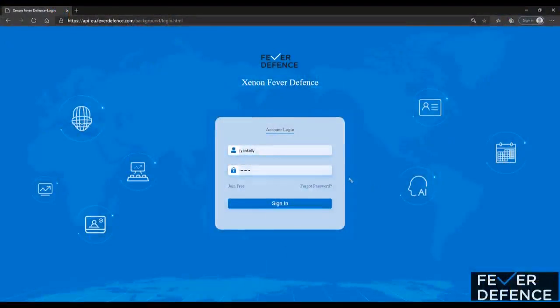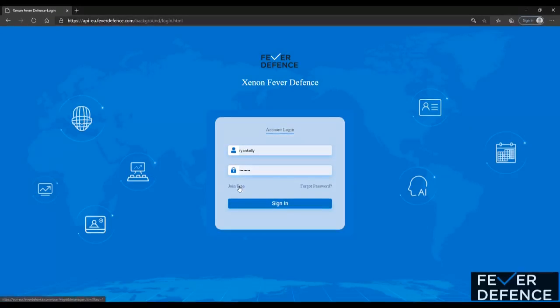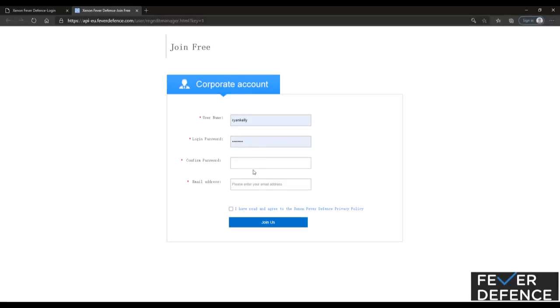So now that you're on your online platform, what you'll need to do if you haven't done is create an account. Select the join free button, you're going to enter in a username, a password, confirm that password and an email address.